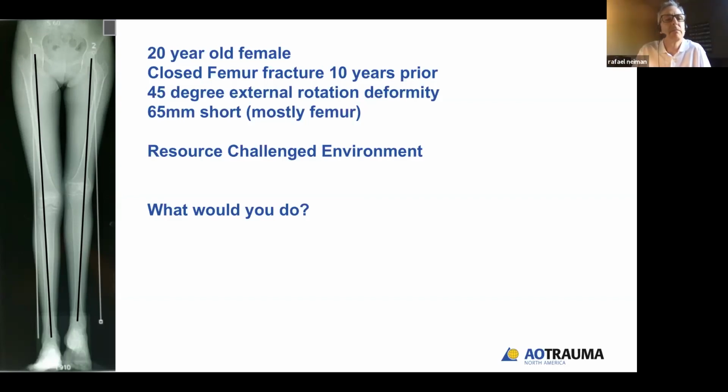I do think that the literature and my experience is that doing lengthenings just with the rail is possible, it can totally work, but it's a challenge. And if I thought I reasonably could incorporate a nail with it, I probably would if I had that available. That's where some of the challenges can occur, because you may have some nails, but you may not have every length or diameter that you want.